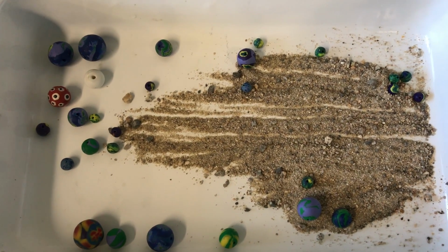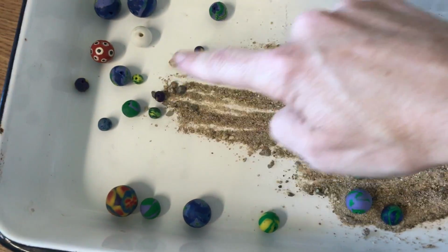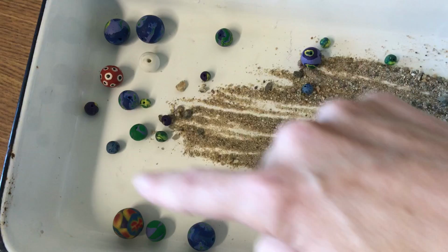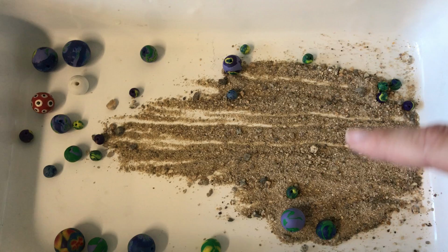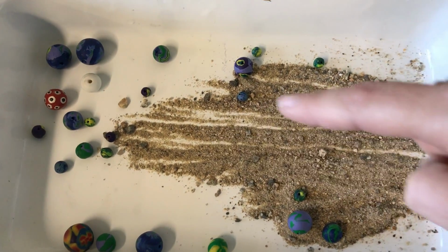So what we need to think about is, in our simulated blood here, we've got out here, this would be like our feathered edge. This is the edge of where the blood smear was. So we kind of incorporate all this stuff out here as the feathered edge, the very outer limits of where things could end up. Back here is the body of the smear, so this is where we started our smear, and then somewhere around about in here would be our monolayer.